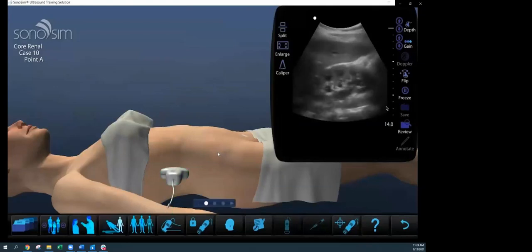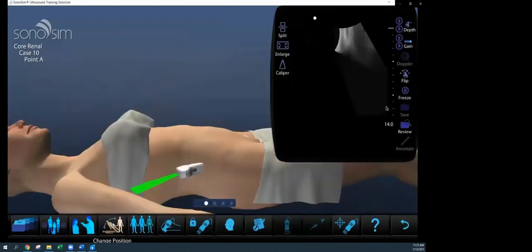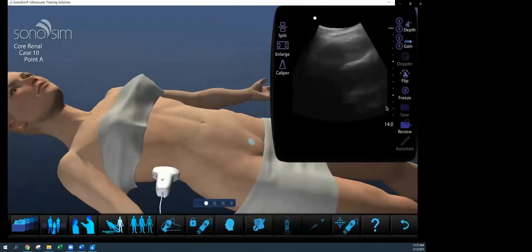So the movement I do with my hands is I fan through the kidney, and the corresponding real ultrasound image appears. It looks like there's some high density calcification, maybe an intrarenal stone here. Here I see some anechoic areas within what should be hyperechoic renal sinus fat. And this looks like mild to moderate hydronephrosis. I can reposition a patient to a variety of different body positions based on my scanning preferences. Here I'm going to leave her in an oblique position.